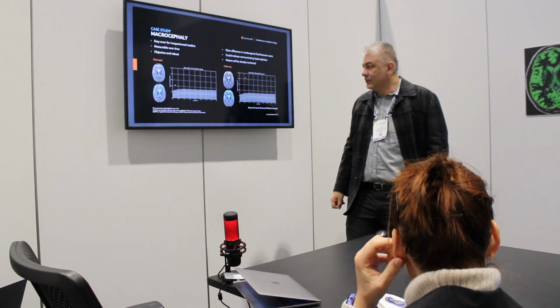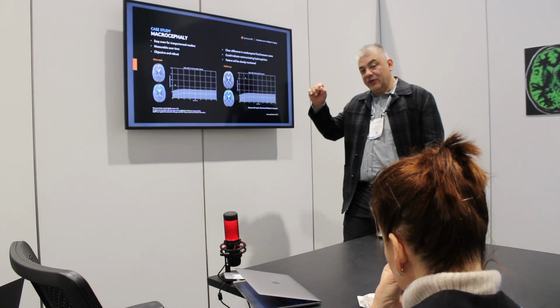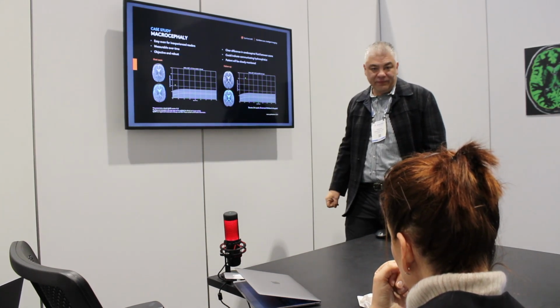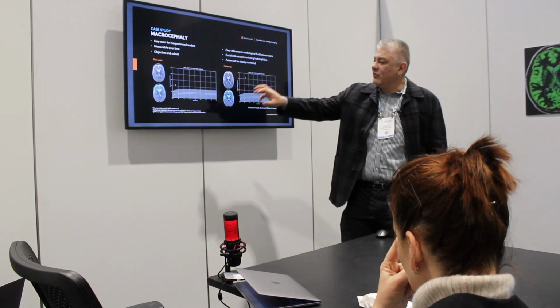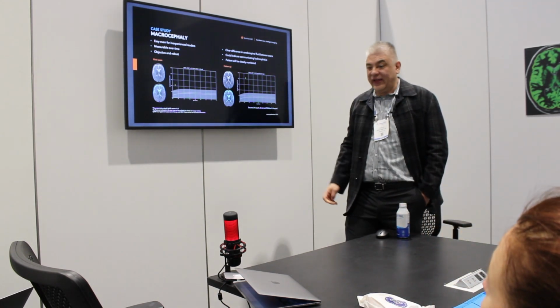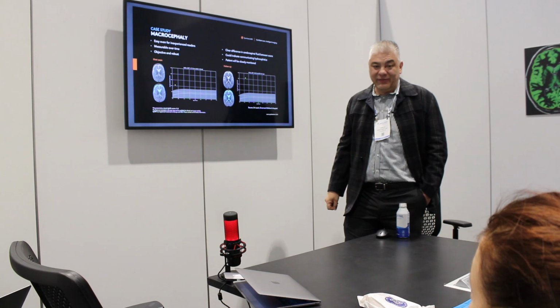What about the myelin in this case? No, this is not a myelin map. This is a CSF volume map. It's a different map. We can do myelin maps, and they are all generated at the same time. You have them all. You have the myelin map, and you have the CSF volume map. But in this case, for macrocephaly, we're just looking at the CSF volume. So we can objectively evaluate this macrocephaly case and say, yeah, there is a really bad increment in volume, even if the images don't look like much.